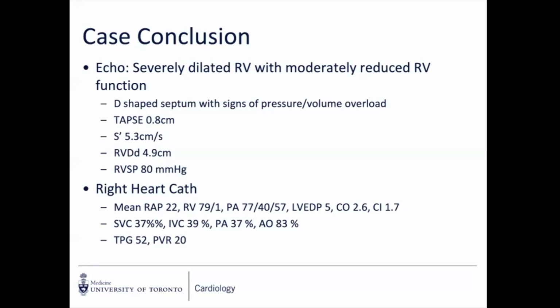She has no prior past medical history. She was just referred to an outpatient cardiologist with worsening dyspnea over the last 1 to 2 weeks, and they did an outpatient echo in an outside clinic, and she was found to have a very large pericardial effusion, as well as signs of pulmonary hypertension with RV dilation on the outside echo. And she had moderate to severe secondary tricuspid regurgitation in that context.